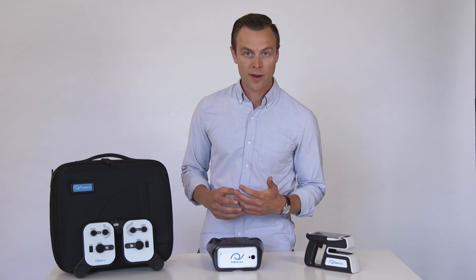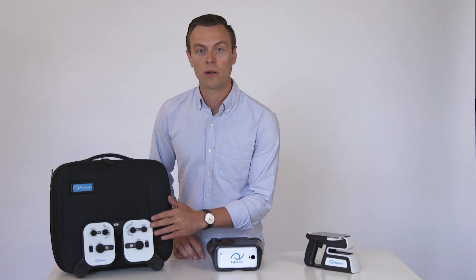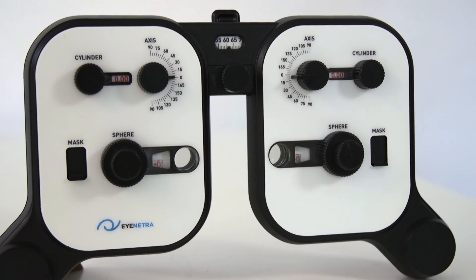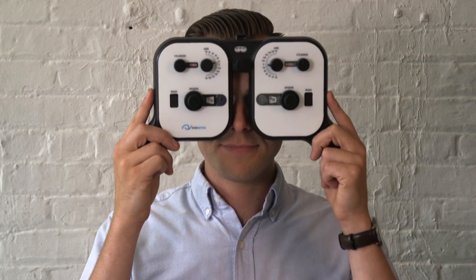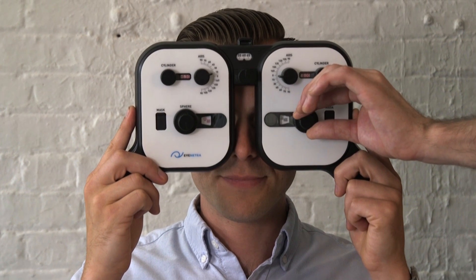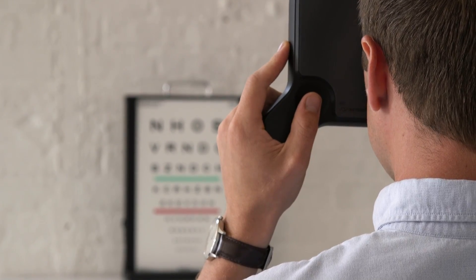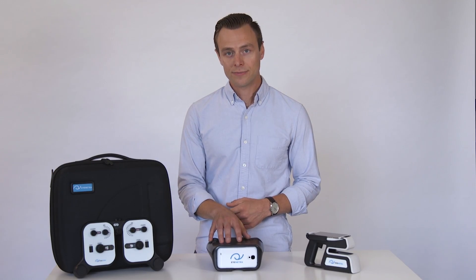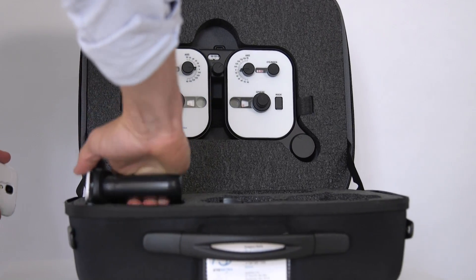And lastly, to refine our refraction values, we have our portable handheld Netropter. The Netropter has a full range of spherical and cylindrical lenses for validating and refining refractive measurements. Its lightweight, handheld design eliminates the need for a stand, making it a versatile tool for work at home or on the go. Refraction, refinement, and lensometry in one briefcase weighing less than 10 pounds.